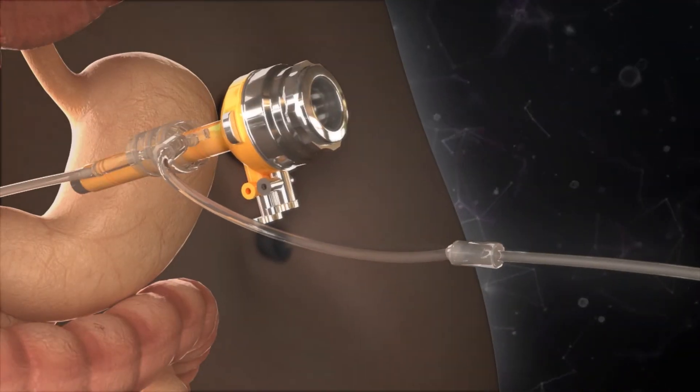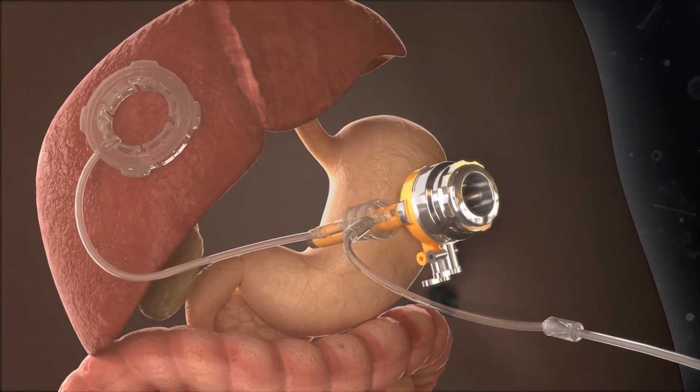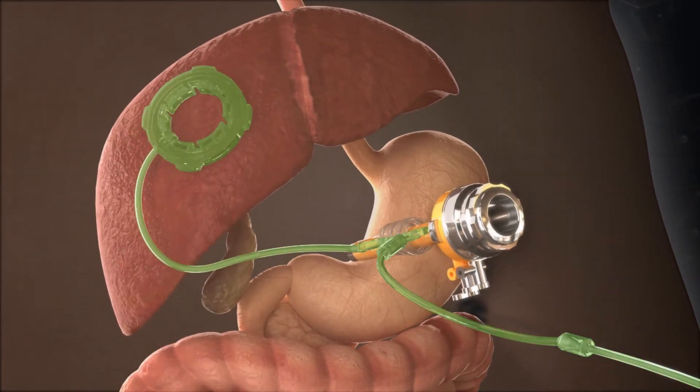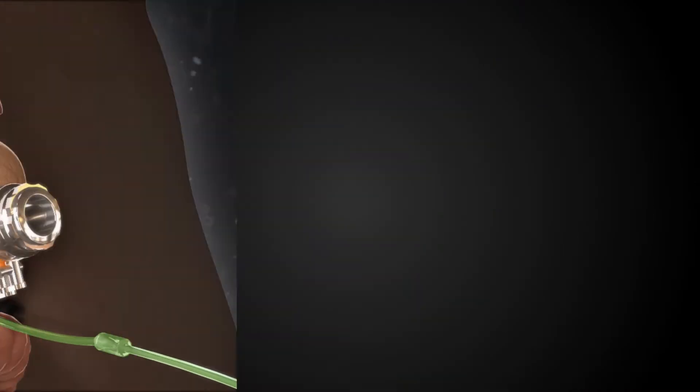The liver is lifted and suction applied, creating a vacuum seal between the surfaces of the liver and diaphragm, holding the liver in place during surgery.